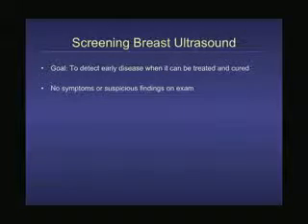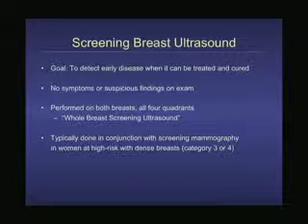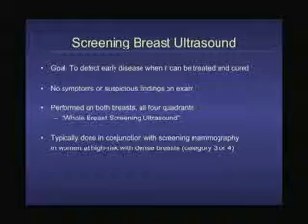So screening breast ultrasound now is a little bit of a different bird, because remember, with screening, they can't have any symptoms. It's not that we saw anything on the mammogram. And now typically they'll do it on both breasts, and it's called whole breast ultrasound screening, or whole breast screening ultrasound, okay? It's typically done as well as with a screening mammogram, but typically only in patients that have very dense breasts, right? Because they found if you have a fatty breast, mammography is fine, it does well enough. And it's in those fatty breasts where ultrasound doesn't do as well, right? So it's not a good complementary technique.